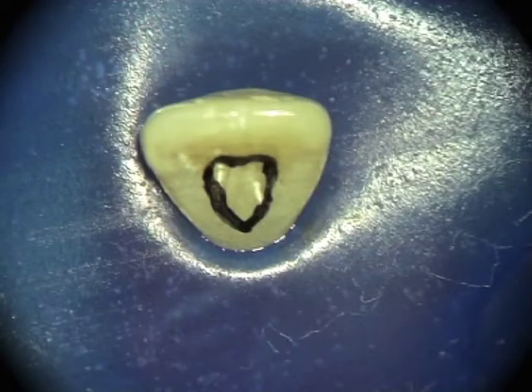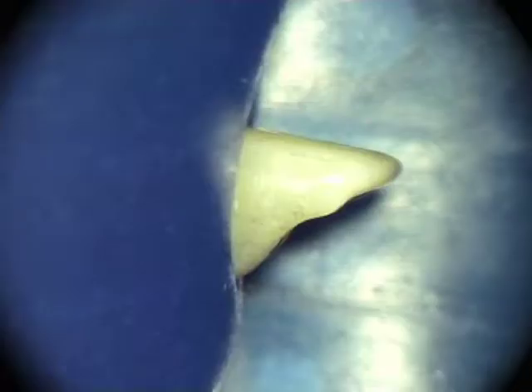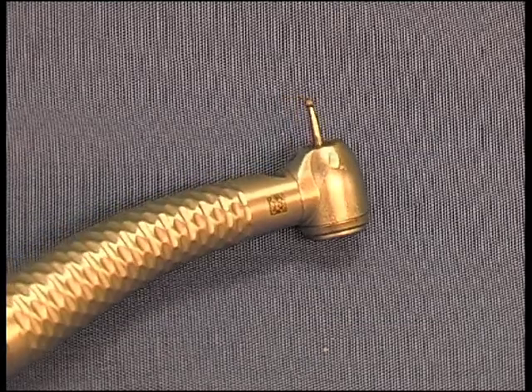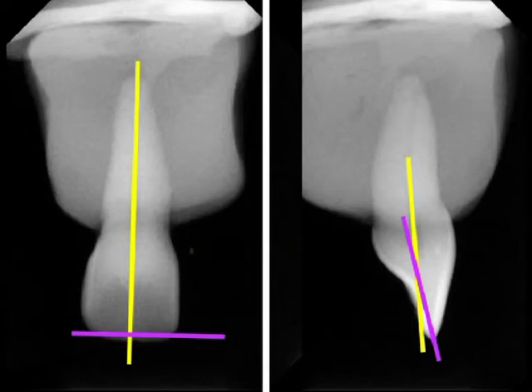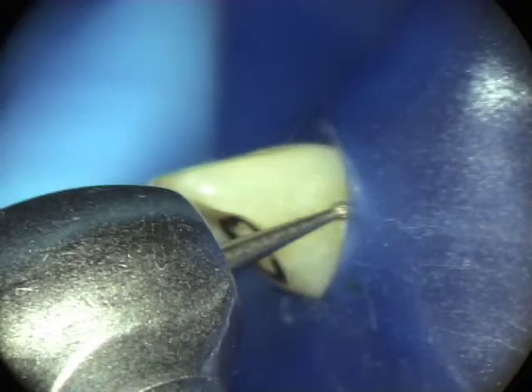The outline of the access cavity is determined from anatomical knowledge and the radiographic findings. Usually, it is on the palatal aspect of anterior teeth. A round diamond burr in a high-speed handpiece is chosen to cut through enamel. Before starting to cut the cavity, practice orientating the burr to give the correct line of access.